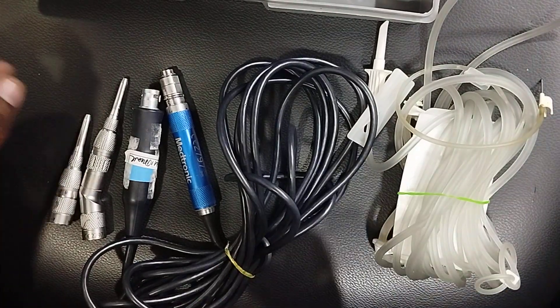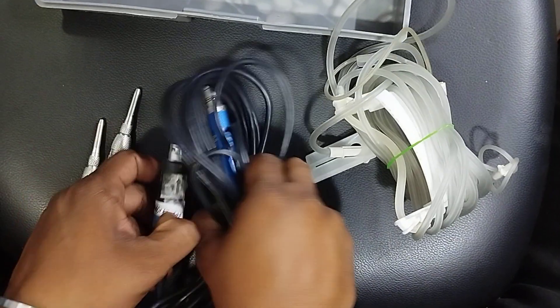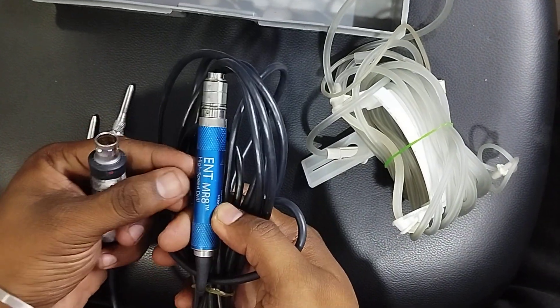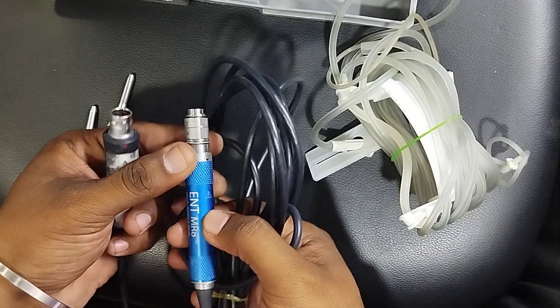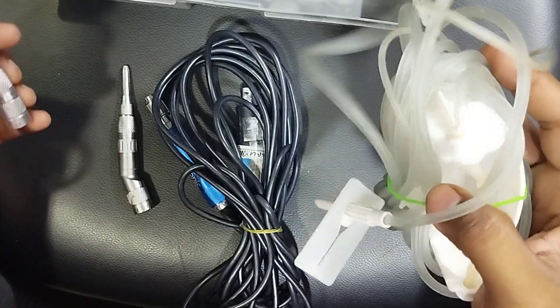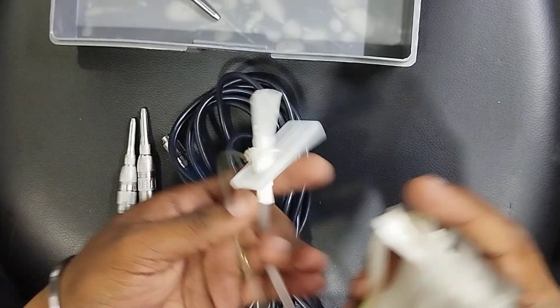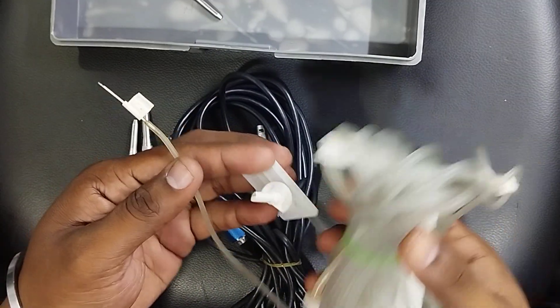Good morning. Today I'm going to show you how to connect the irrigation tube in the ENT MR8 motor. This is the MR8 motor from Medtronic. So many people have a doubt about how to put the irrigation tube in this motor. This is the irrigation tube for this kind of MR8 motors.